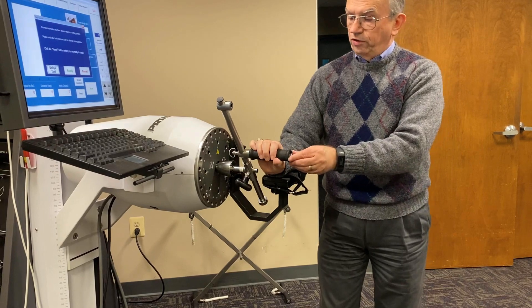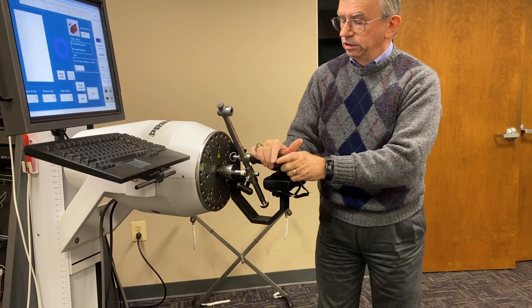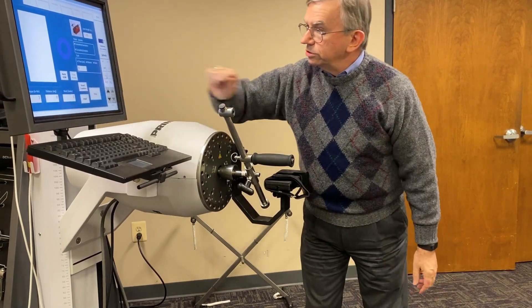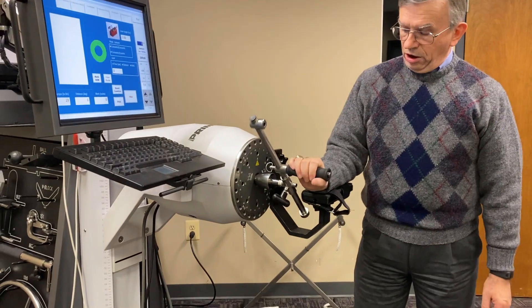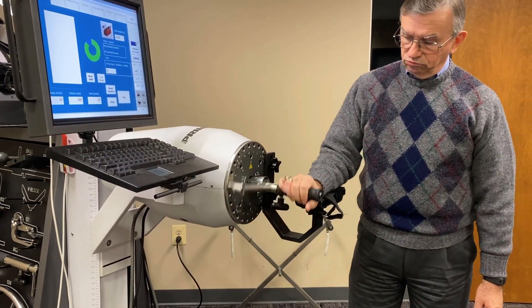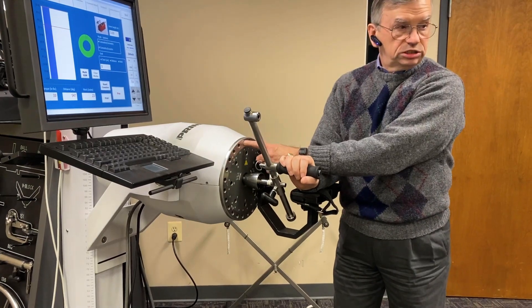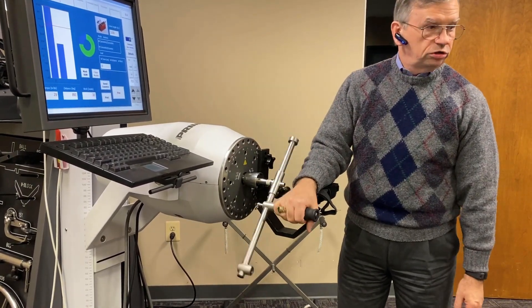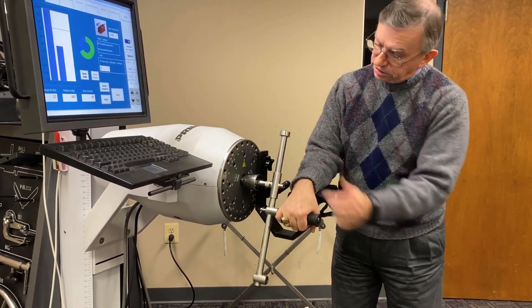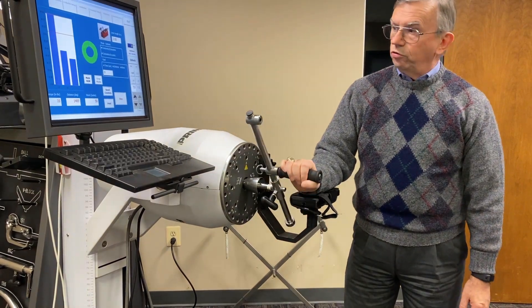So now if I want to do flexion, I'm going to start fully extended and press ready. Now I've got 24 pounds, so I'm going to turn that down. Now I can do wrist flexion and go through the full range. If I put a range of motion stop in, then they'd have a visual goal because they're going to want to do these short strokes. You put a range of motion stop in and say you've got to go until the bar touches — that'll keep them going through the full range.